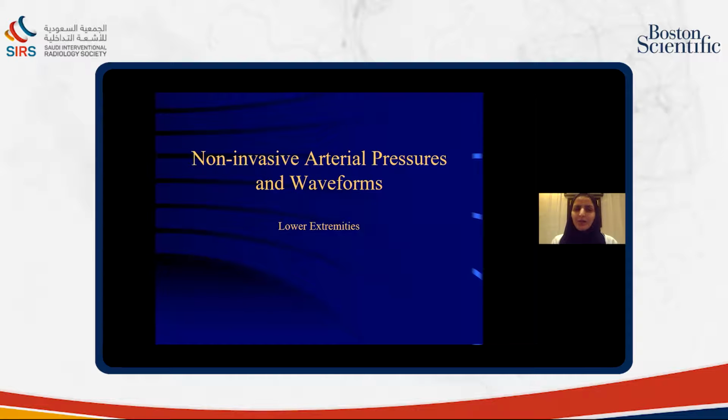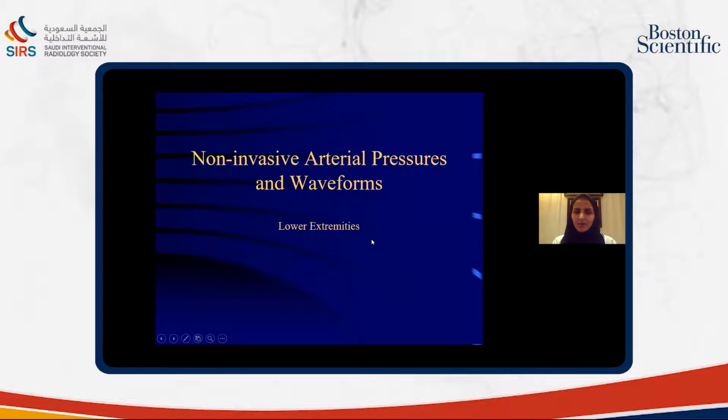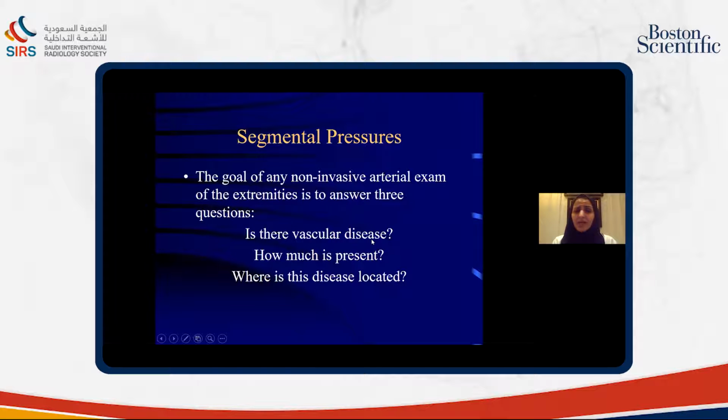Now we'll talk about non-invasive arterial pressure and waveform for the lower extremities. The goal of any non-invasive arterial exam of the extremities is to answer 3 questions. Is there any vascular disease? How much is present? And where is this disease located?